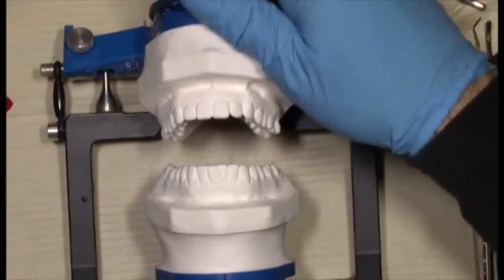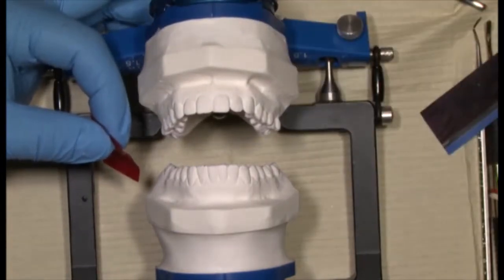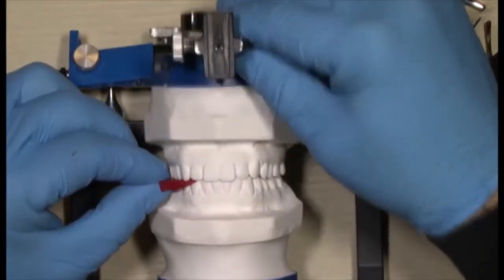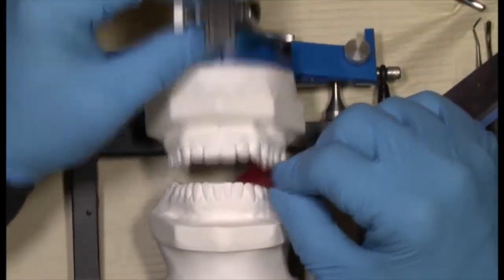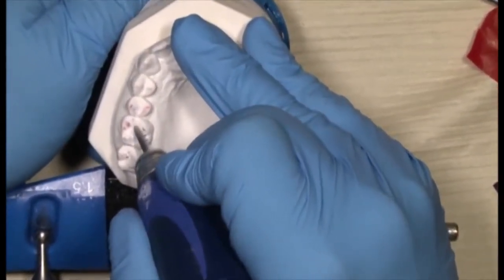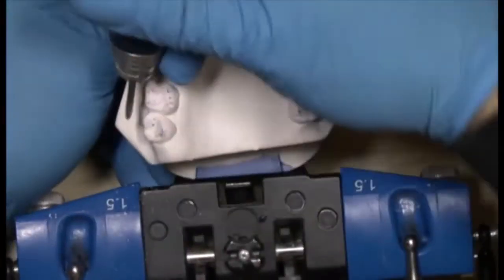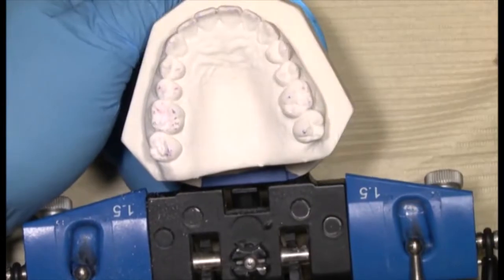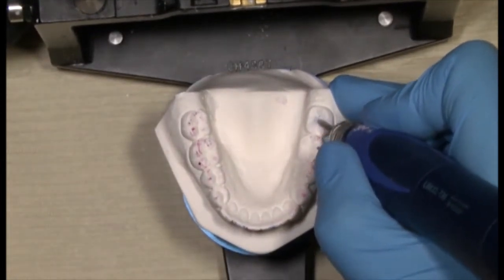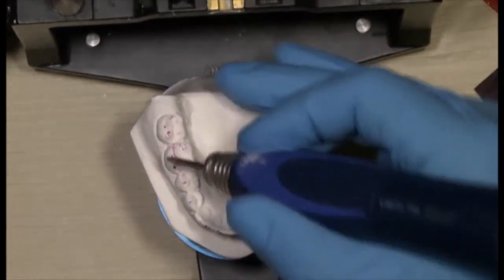And sometimes it's a good idea to just go back and forth with different articulating paper to be sure that you're not staying with any false positives or false negatives. And you can see it's still on mostly the right side. Deepen the fossa. Do not touch cusp tips ever.